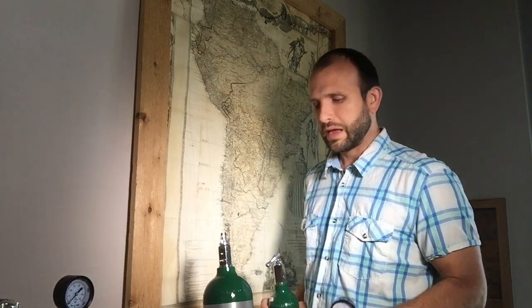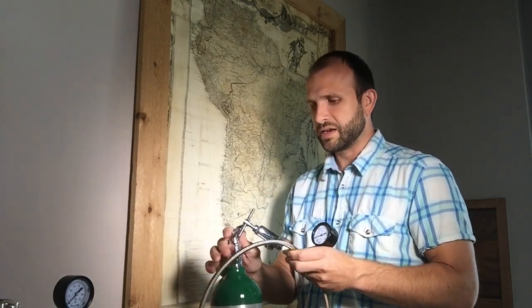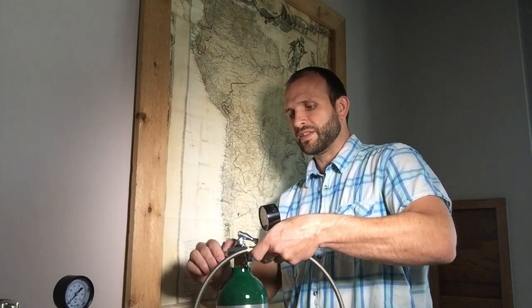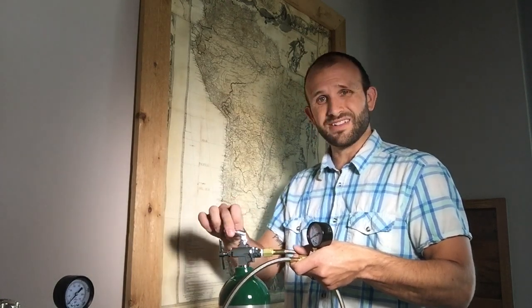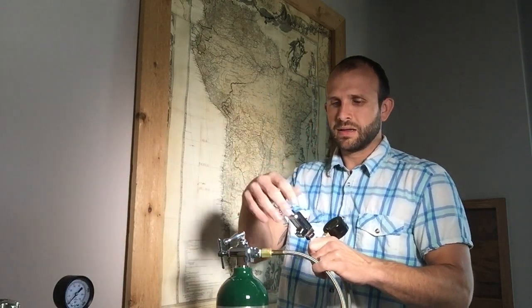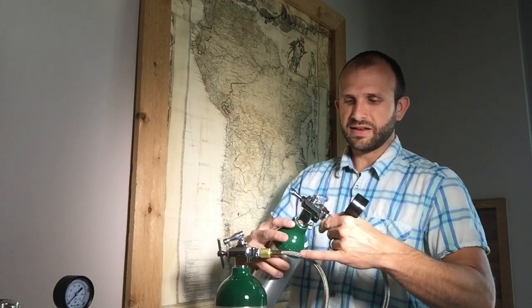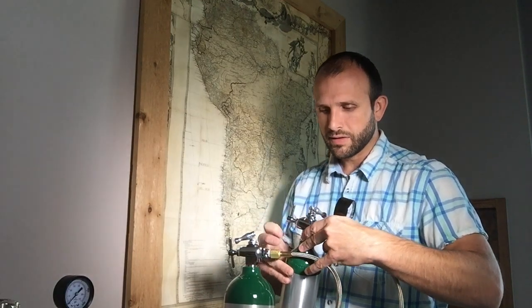Now if I'm going to transfer oxygen from a medical tank to a medical tank, the process is the same as from an industrial tank to a medical tank. I'm going to take my 870 medical connection and slide it over the stem and the toggle valve. Some medical tanks won't come with a toggle valve — they'll just have the stem and you'll need to use a wrench to turn it. It's easier to use toggle valves, so I order them with those on. I'll take my other small tank, screw the connector out to make room, run it over the stem, and let it seat down onto the prongs. Then I'll screw it down so it gets nice and tight.